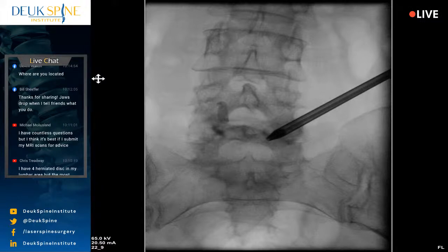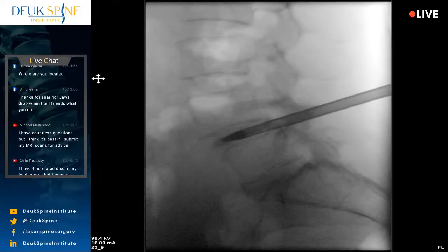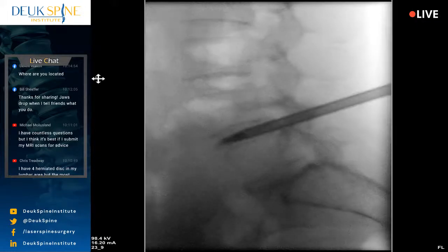So we take different kinds of pictures with the fluoro throughout the surgery, but almost all the pictures are either front back or side to side. And I use that information to recreate where we are in the spine. If you just use one view, like the lateral view, you don't know, are you really inside that disc or not? Maybe you're not inside the disc. Maybe you're on the side of the disc. And that would be a problem because you won't be able to fix the disc if you're not inside.